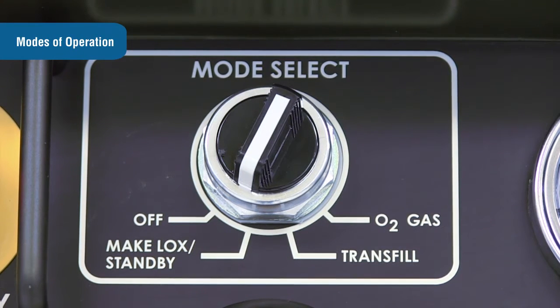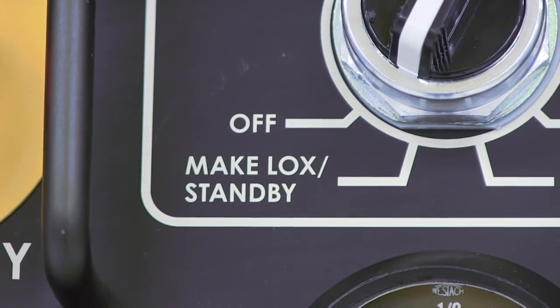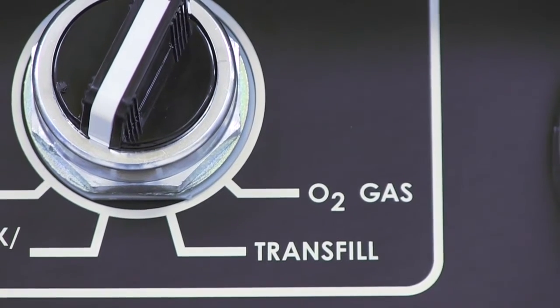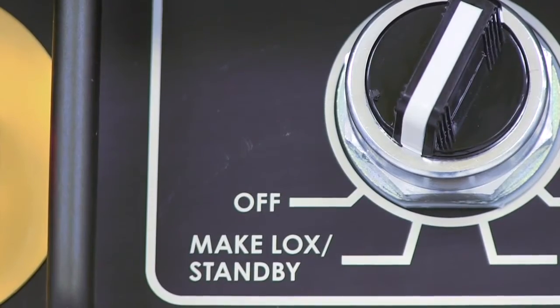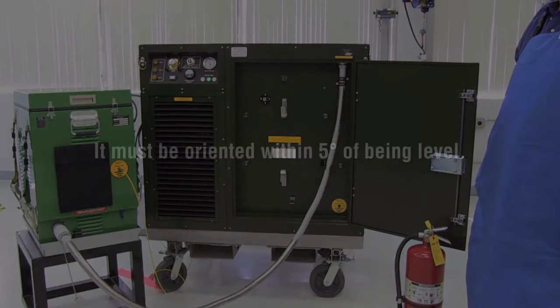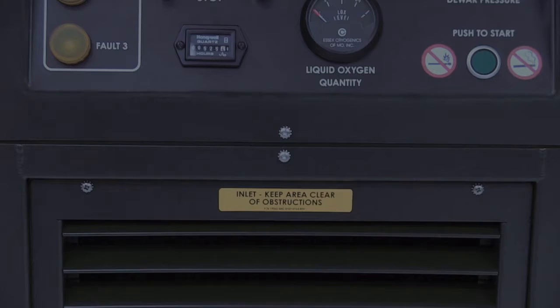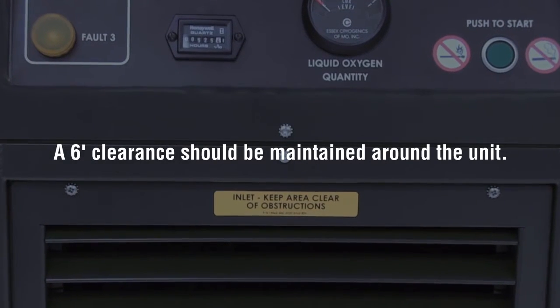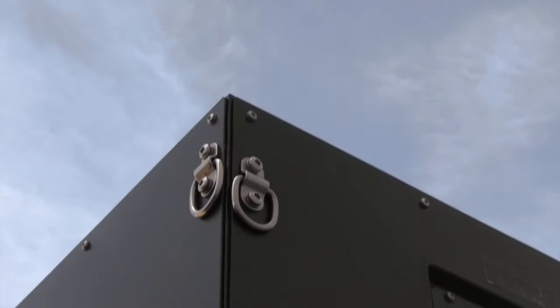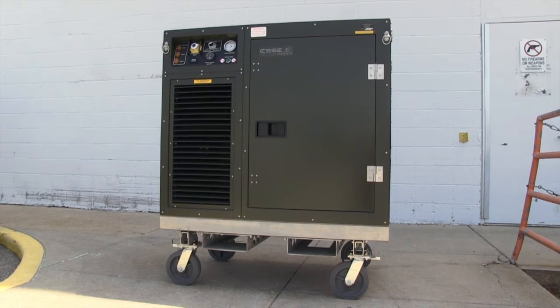The OGL has four basic modes of operation: make LOX, standby, transfill, O2 gas, and off. For the OGL to operate effectively in any of these modes, it must be oriented within five degrees of being level. A six-foot clearance should be maintained around the unit. The OGL is designed for indoor use but can be used outdoors protected from weather and heat by a roof or shelter.